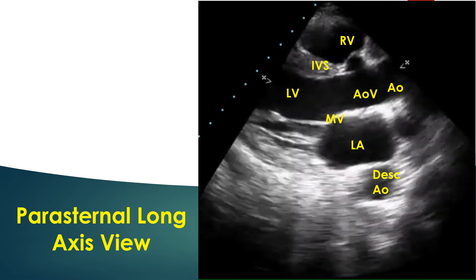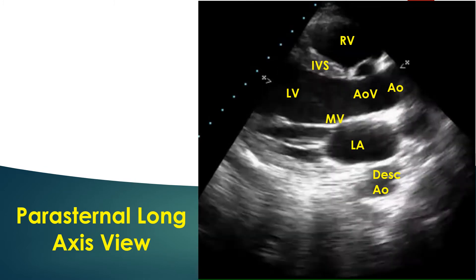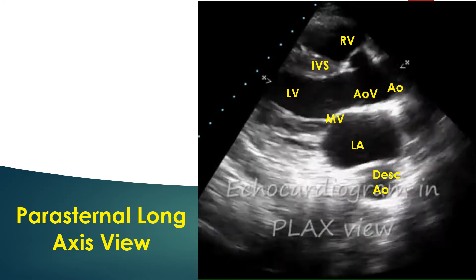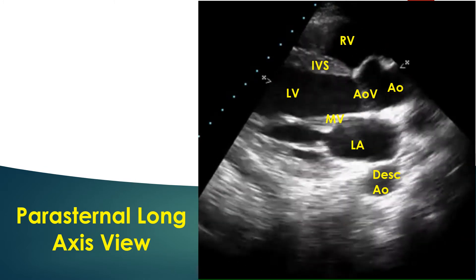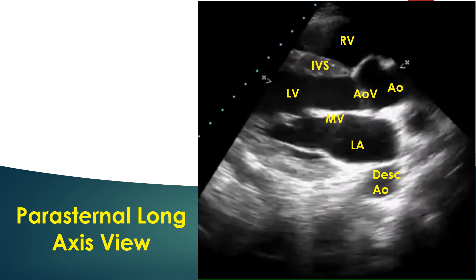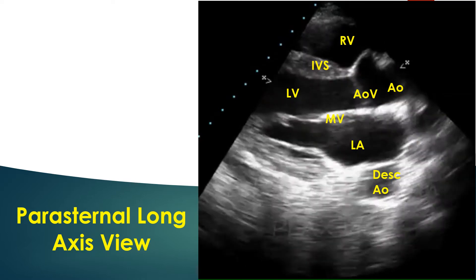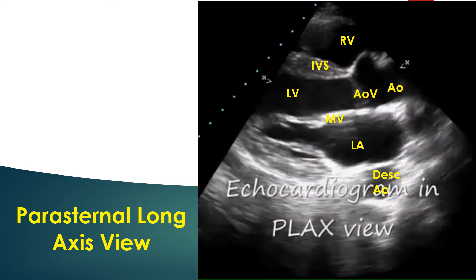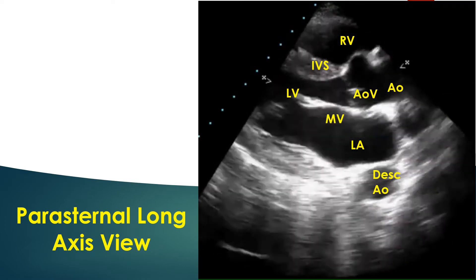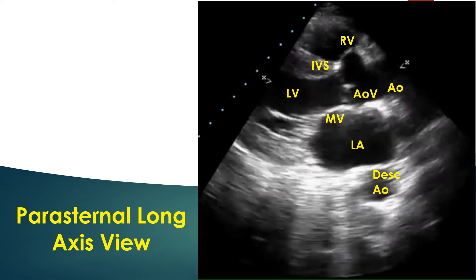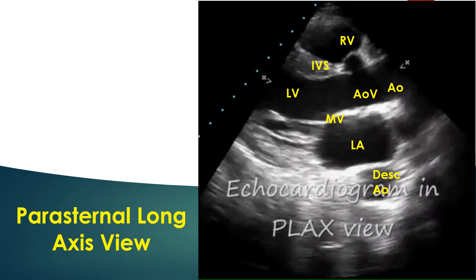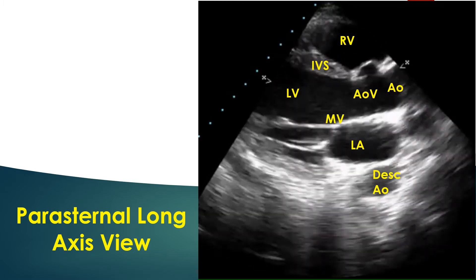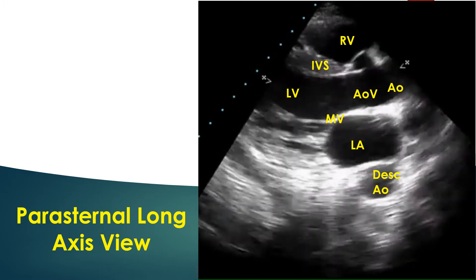Aortic root and valve, left ventricle, left atrium, mitral valve, chordae tendineae, papillary muscles, and interventricular septum, as well as part of the right ventricle, are imaged in this view.